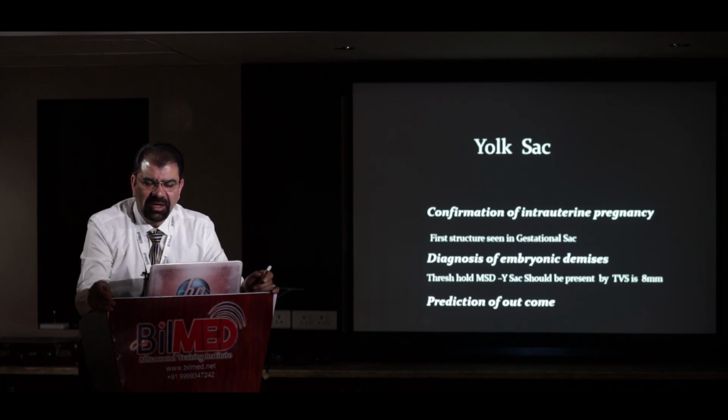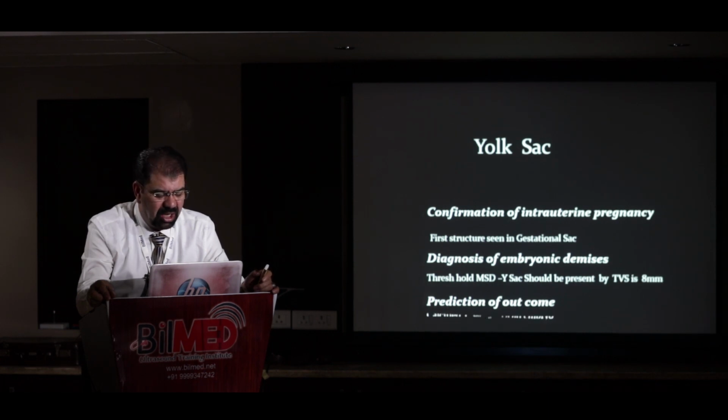So that way, if the patient is having a normal fetus today with normal fetal pulsations but an abnormal yolk sac, it means that I cannot predict whether that fetus tomorrow or a day after tomorrow will be live. So this way, it is predicting the outcome of this pregnancy.